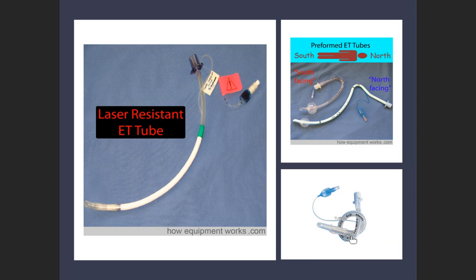It does not kink. So when would we need a tube like that?